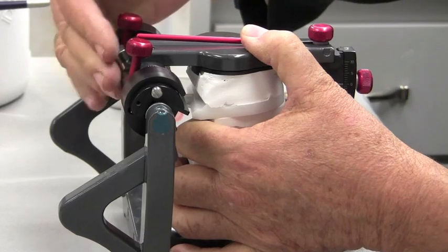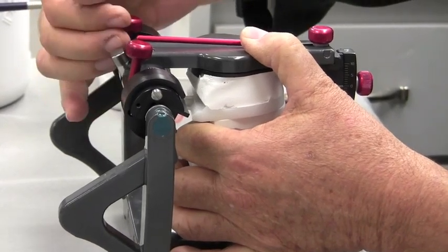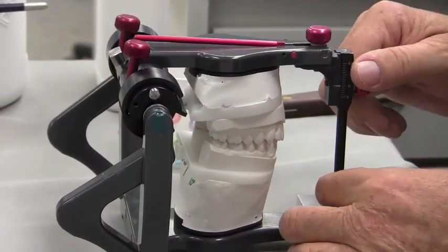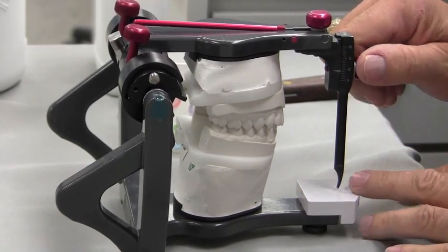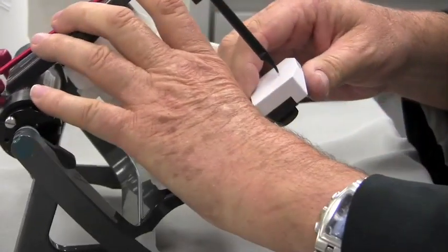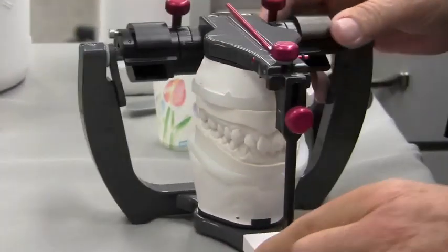We want to unlock our condyles. So if we're in a lock position, lift them up. And we want to make sure that our pin is slightly up so that we don't go all the way through the acrylic to the table when we do it — probably just about a millimeter is fine.